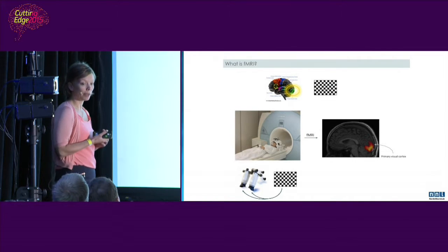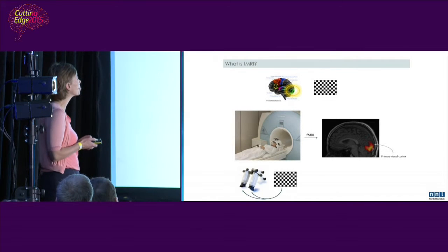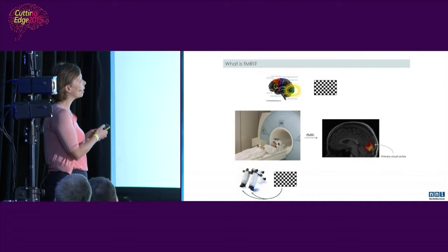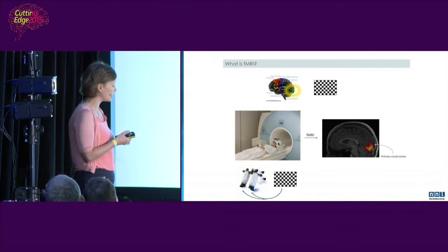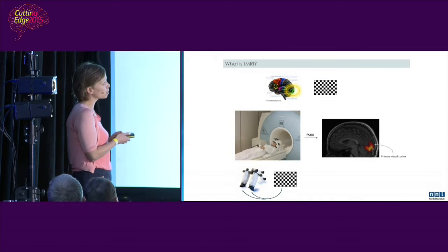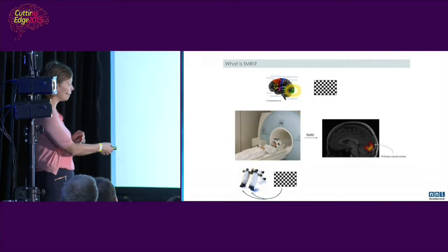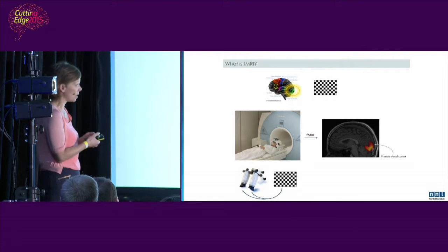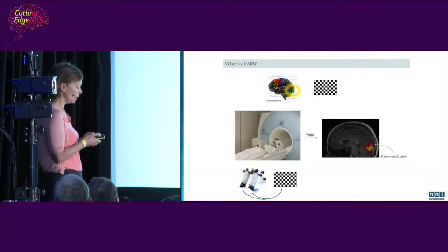So we've heard already a little bit about fMRI. I'm going to explain very simply how it works. As I already told you, when we're exposed to visual stimuli, the visual cortex will respond to that stimuli, and we will get increased activity in that region. If this type of exposure is done inside the MR scanner, for example, visual stimuli can be provided on a small screen inside goggles, which the subject in the scanner is seeing, then we can detect this increased activity in the brain using fMRI.